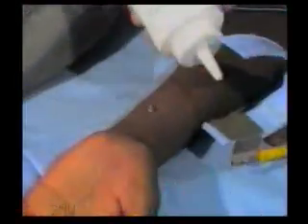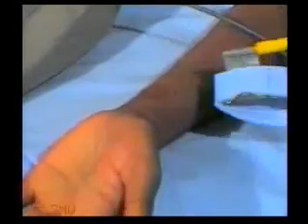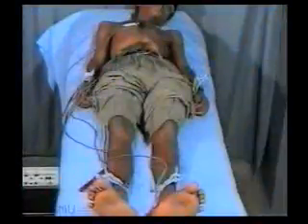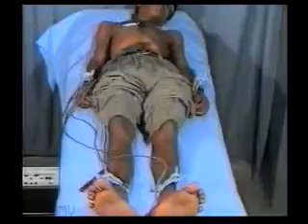The leads are placed in contact with the body surface at different fixed points. An electrode jelly is applied to have proper skin contact with minimal resistance. The 4 limb leads are tied to the 4 limbs over the forearms and the shins, where there are minimal muscles, because muscle twitchings can cause electric interference.